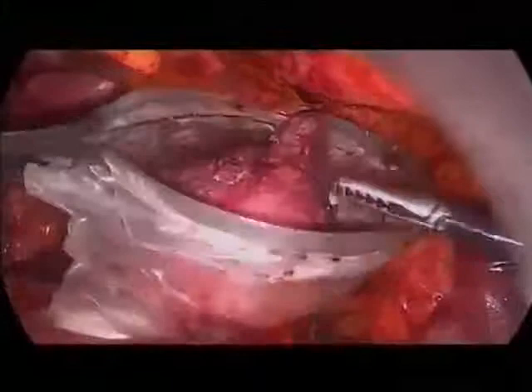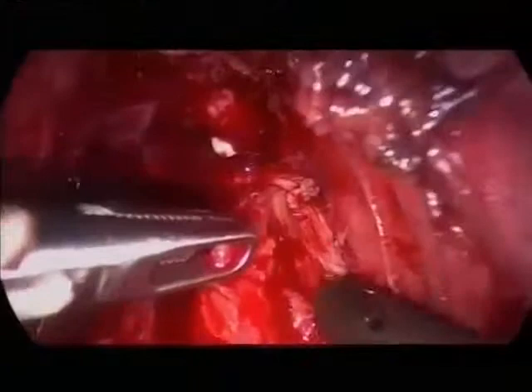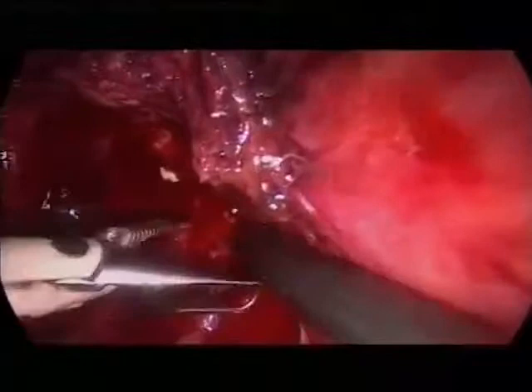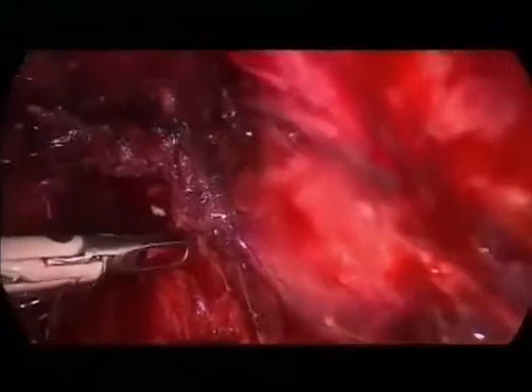Okay, so we move over to Vito? Richard for a moment, and you check for the bleeders. So Richard? You see, Uwe, I have dissected completely the right side of the prostate. And I have dissected laterally the bladder neck, so now I am cutting the bladder neck.